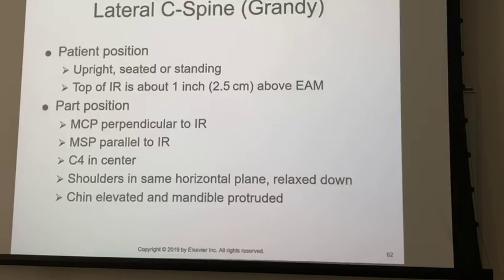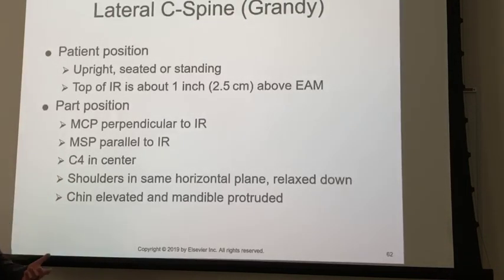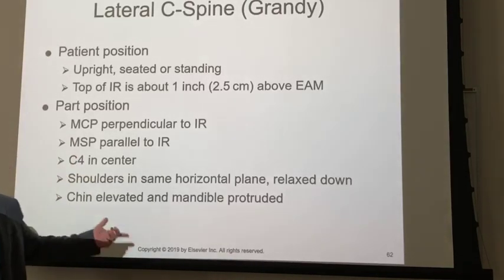Okay, so lateral is absolutely the most important view. You see everything on the lateral. So if at all possible, I'm going to have my patients upright for the lateral because they can get their shoulders lower. That's number one. Number two, they can get a better inspiration. If we need to do flexion and extension, we're going to do them upright anyway. And you can get 72 inches a whole lot better with the patient upright. So, if it's a walk-talk patient, they're going to be upright.